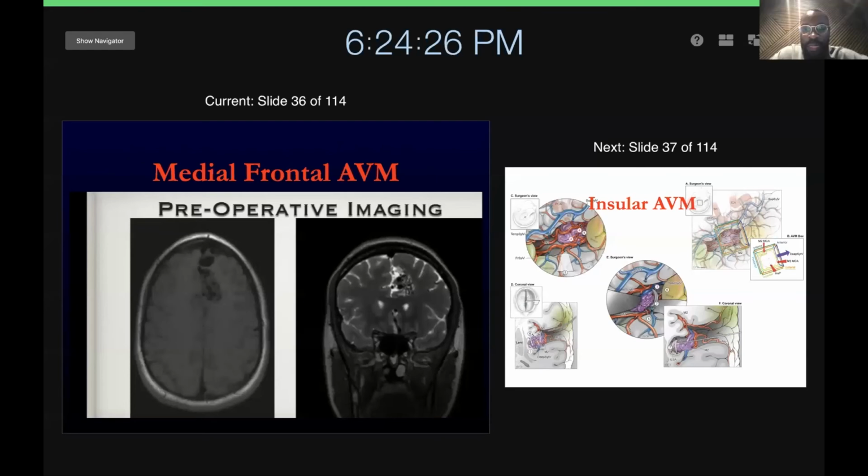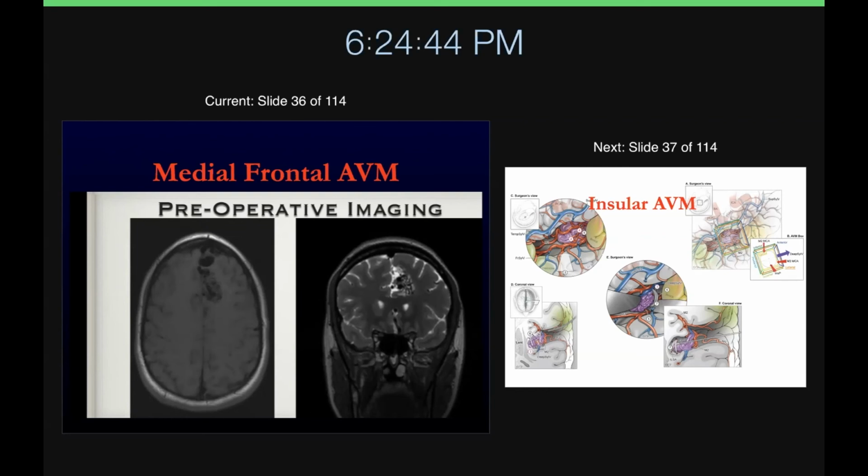And you can see now, the deeper we go around this thing, it starts to turn a little blue. You see how the AVM is starting to look a little quiet? And here I'm seeing into this little space here on the lateral border, and gravity is helping me. It's actually pulling the AVM out of the frontal lobe just by the way that I've got things positioned here.